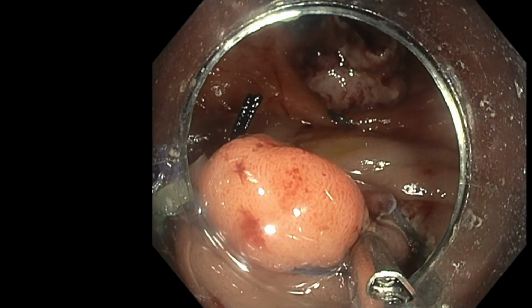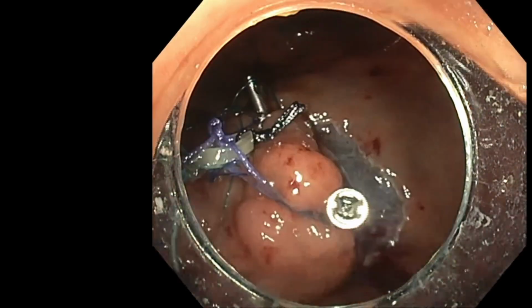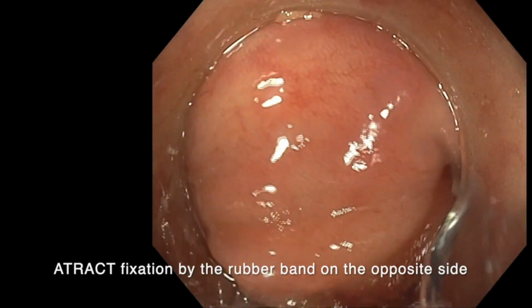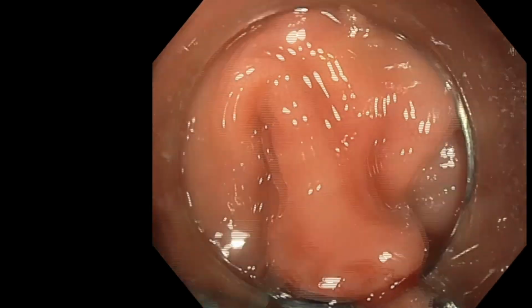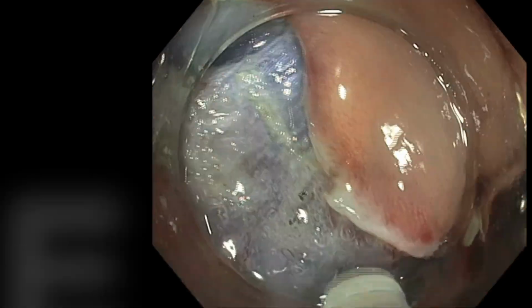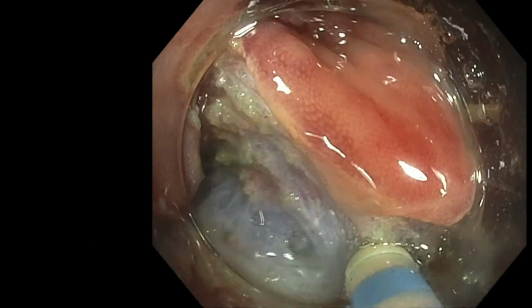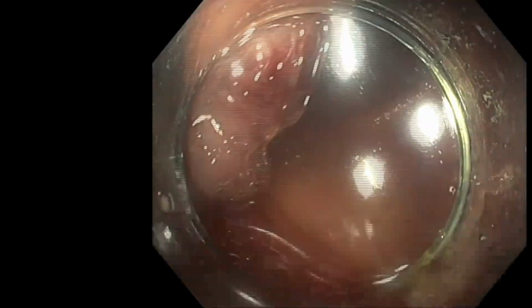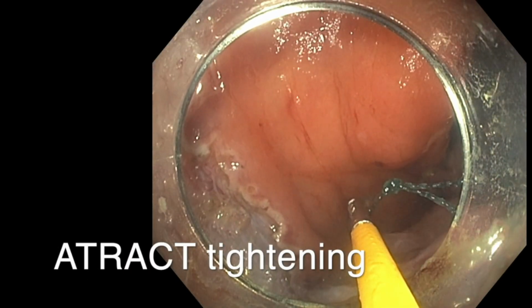And either now or a little later, I will fix the rubber band to the opposite wall in order to get a real 90-degree, if possible, countertraction to open the space and increase the speed of the resection by exposing the submucosa better. So we use a conventional clip, and once you have this traction fixed to the opposite wall, you can see that the exposure is better, and because the fibers of submucosa are stretched to the opposite wall, you will have a better speed because everything is condensed.